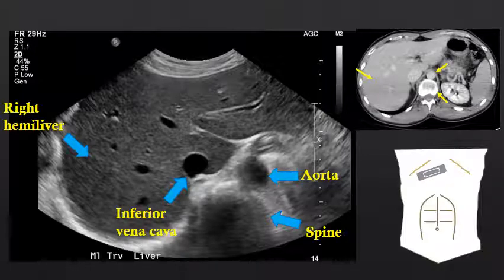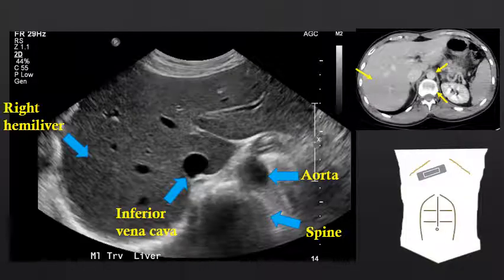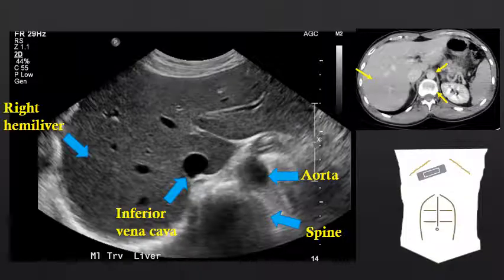And we can see the inferior vena cava — in this instance, the intrahepatic portion of the inferior vena cava — just to the right of the aorta, also superficial to the spine.